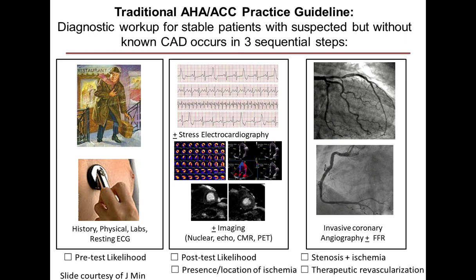There are also fundamental limitations as it relates to stress tests. Stress tests will obviously play a continued very important role, as we saw just very elegantly from Dr. Leiner and is highlighted in the SCMR guidance. Stress perfusion MR, for example, is a tremendous tool as it relates to the adjudication of a number of clinical conditions, but I would posit to you that it's generally not the best test as it relates to determining whether or not the patient has coronary disease.